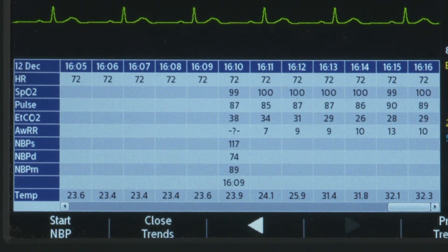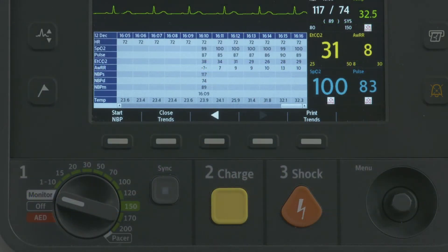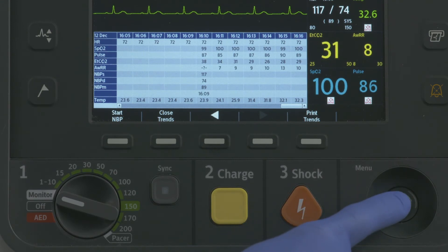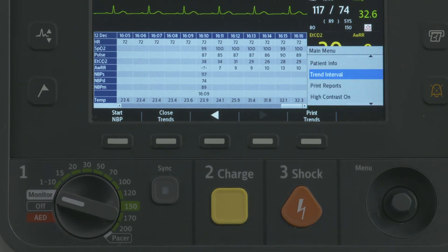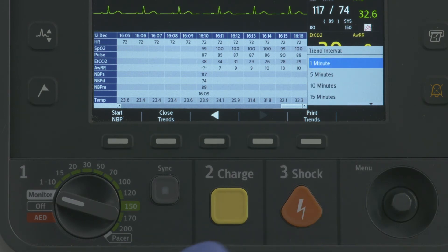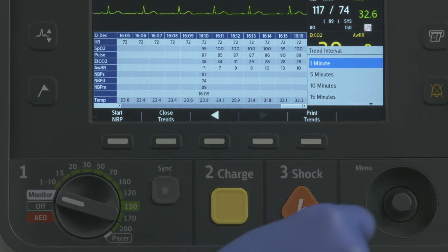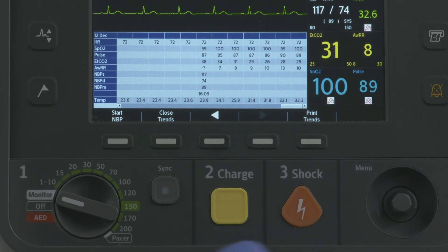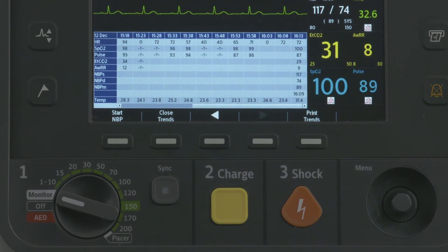You can adjust the display's time interval for the current patient. With VitalSigns trending active on the display, press the Smart Select knob. Navigate to Trend Interval and press the knob. Use the Smart Select knob to select the trend interval you want and press the knob.